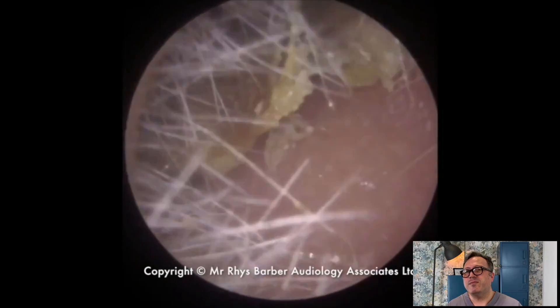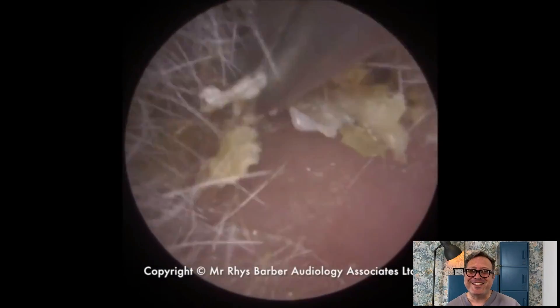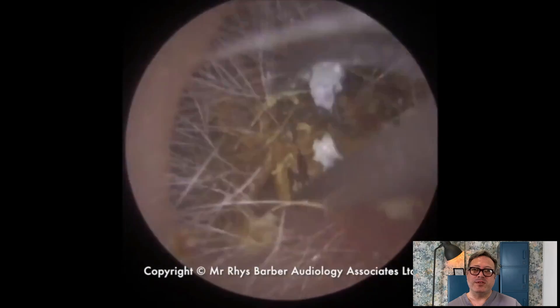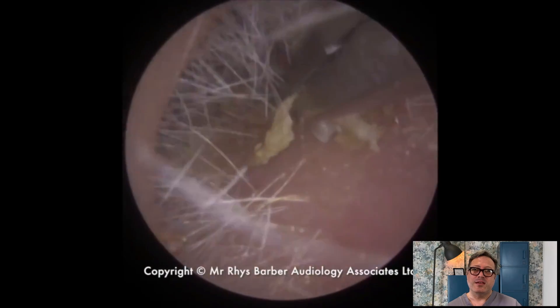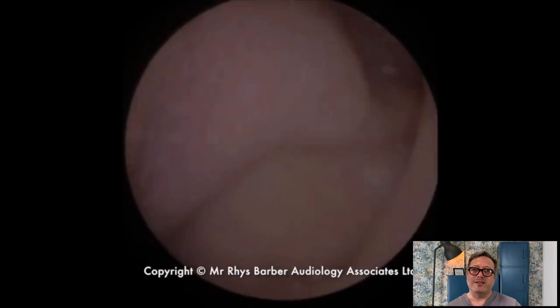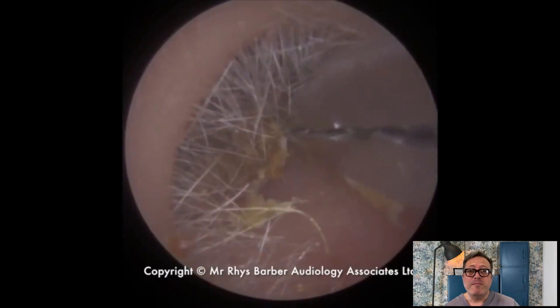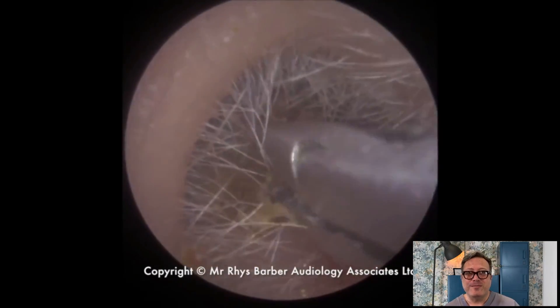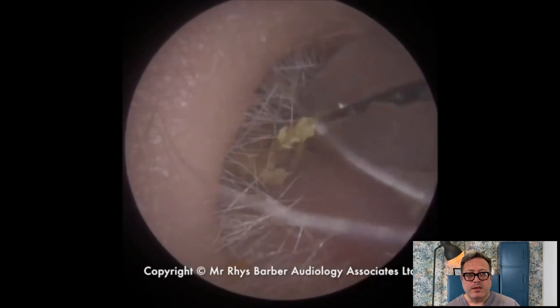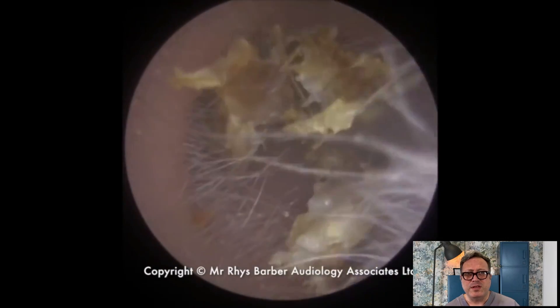I've got a hold of that slightly softer skin there but I don't think it's going to hold very well, so we're going to need to bite into it a little bit further. I'm tilting my head to try and see around the corner. Let's pull this down — oh, it's almost there, it's almost there. It's going to shear again I think. Okay, we're just getting a grip on this bit of dry skin — look at this coming away now. Wow, that's a good piece, that is a good piece.